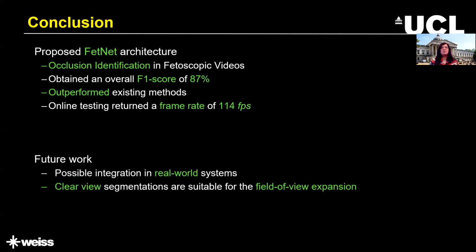As for future work, FetNet can be integrated into real-world systems for automatic event identification, which can facilitate the surgeons in challenging visual conditions. Clear view video segments obtained from FetNet can be used for designing field of view expansion methods.